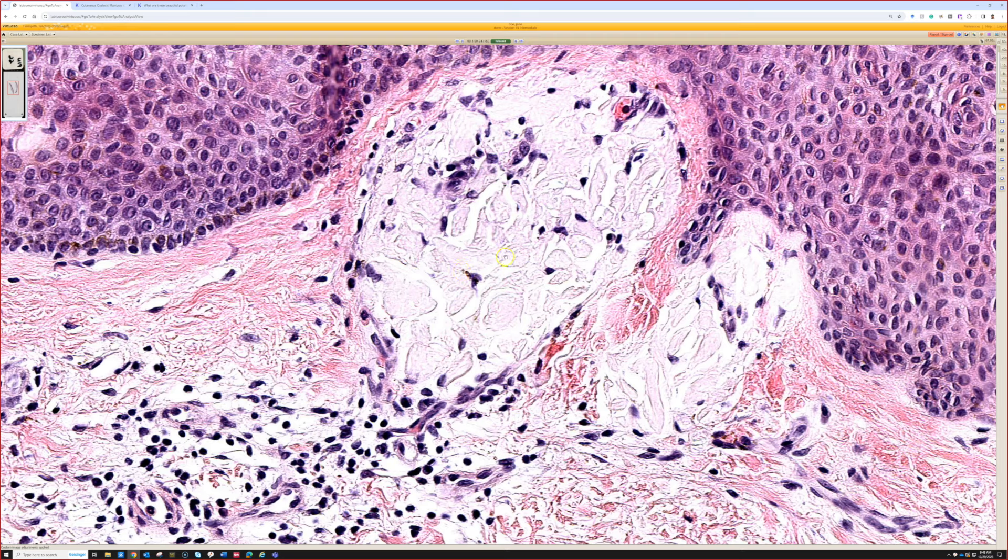I see this next to seborrheic keratoses, basal cell carcinomas, and other epithelial neoplasms — both benign and malignant — probably multiple times a week. The reason I'm bringing this up in this video is so that you recognize it: this does not mean anything clinically. This is a benign incidental finding that is not associated with systemic amyloidosis, not associated with myeloma, and not associated with AL or light chain type amyloid.